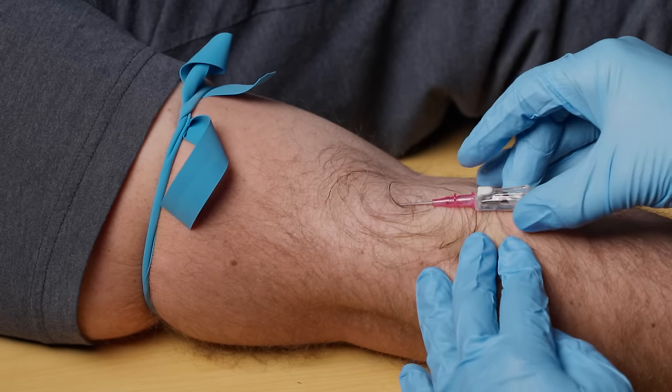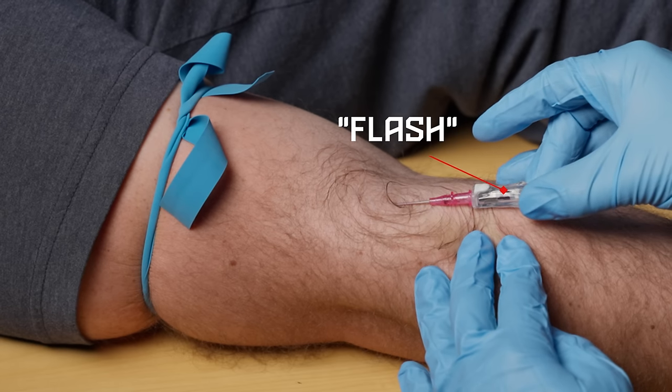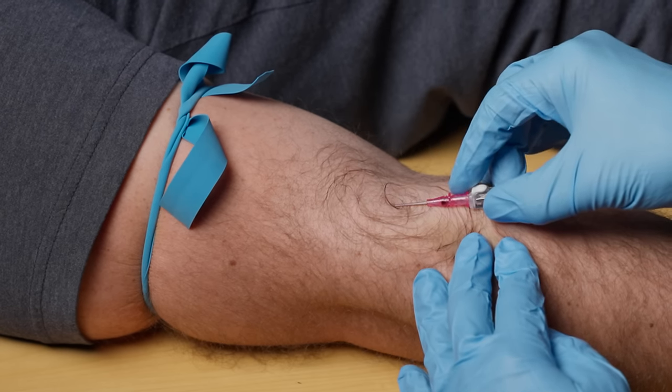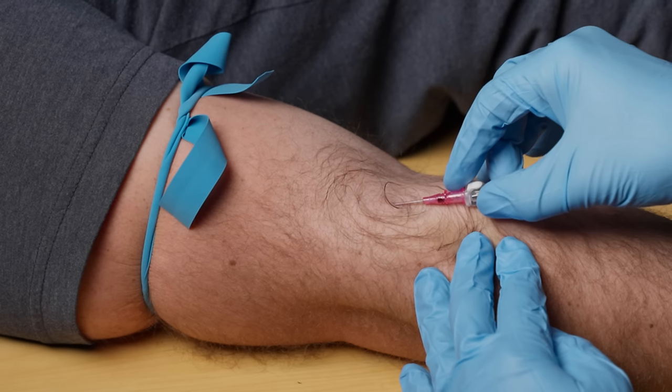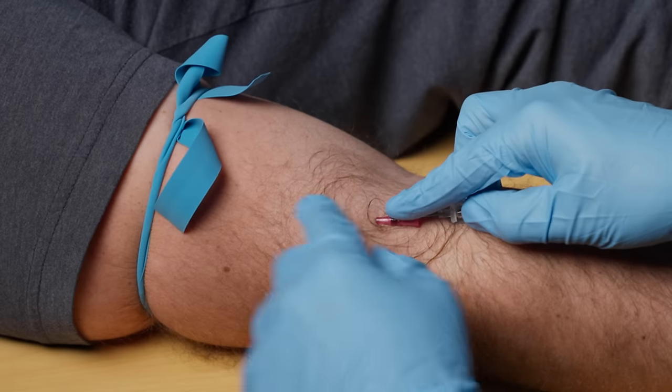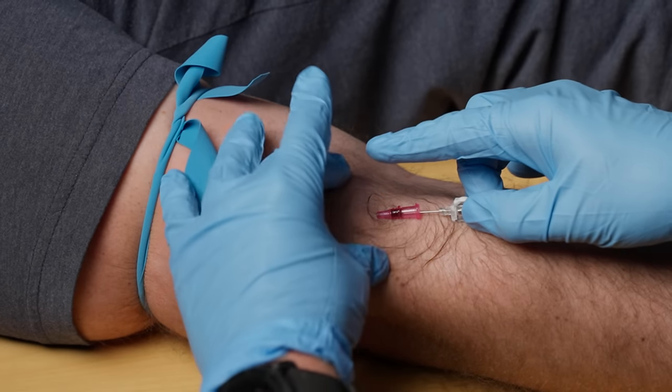I've got Brian's arm right here — I'm going to go towards the skin, insert, and I'm watching the flash chamber to see when I have flash. I've got flash in the flash chamber and as that's filling up I don't want to start threading just yet. I want to insert just a little bit farther and then I'm going to insert to the hub with that finger. You can also use this hand to insert it in as well.